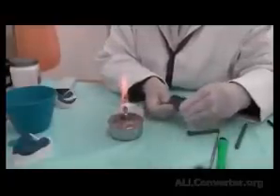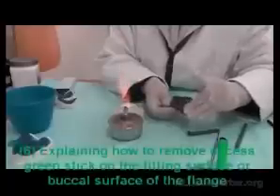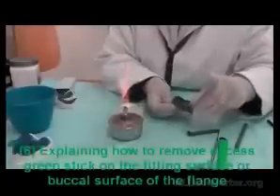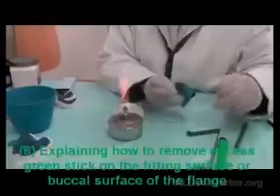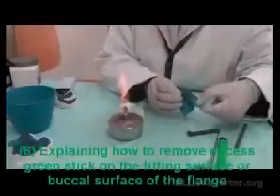It's no longer sticky to my gloves. This is why I'm cooling it with the warm water. I'm gathering the material. Anything on the fitting surface, once more, I'm pushing it out. Anything on the buccal surface, I'm squeezing it on the border.